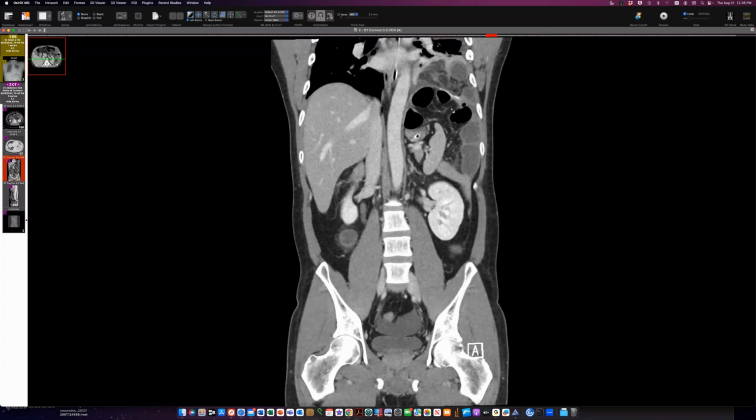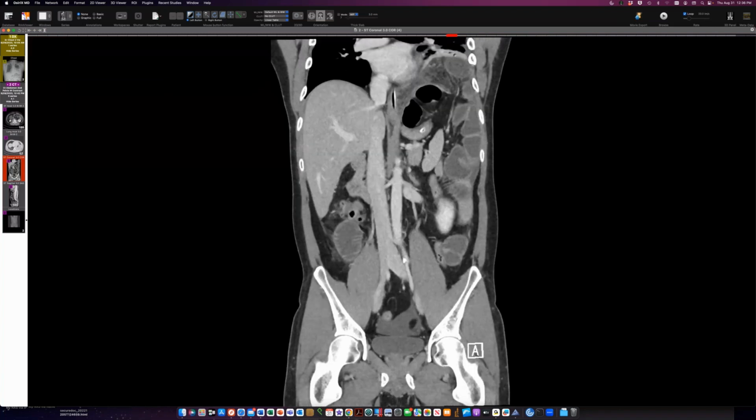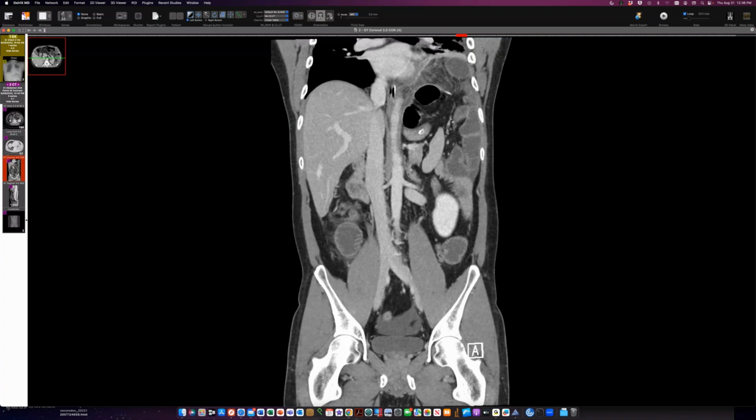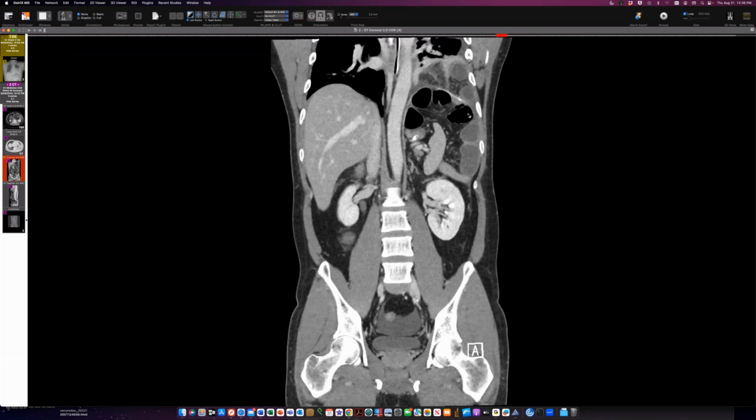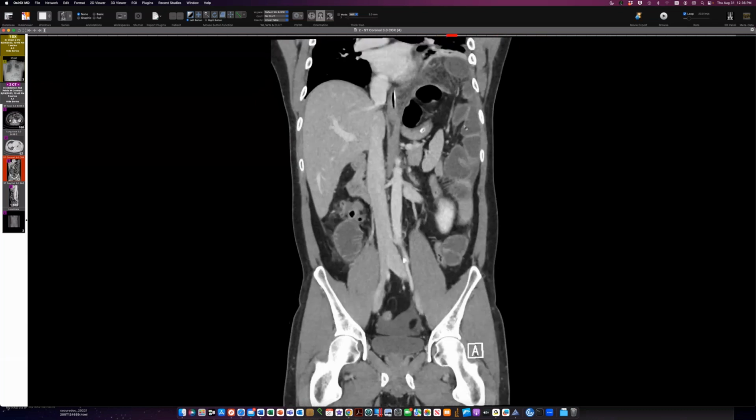So this person has now had this hernia reduced. I don't know whether they had to resect any small bowel in doing that, and is now recovering. So congenital hernia, and then failure of the mesh graft, and new herniation with small bowel obstruction.